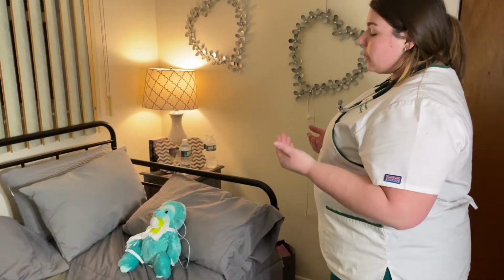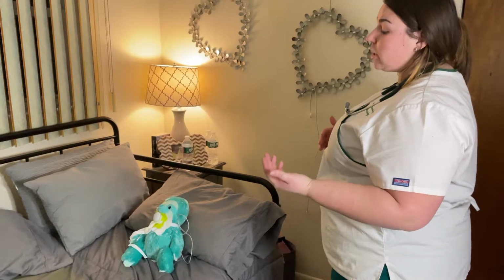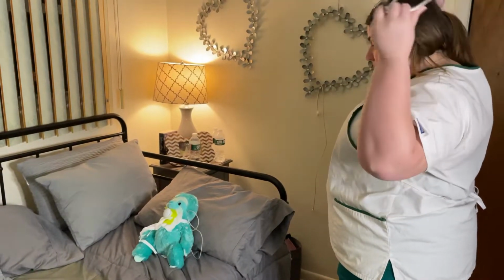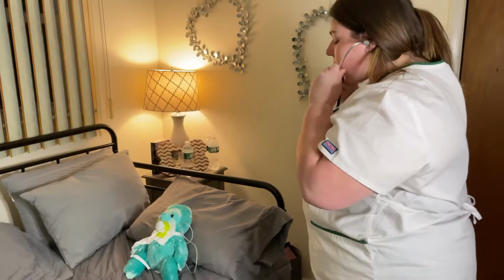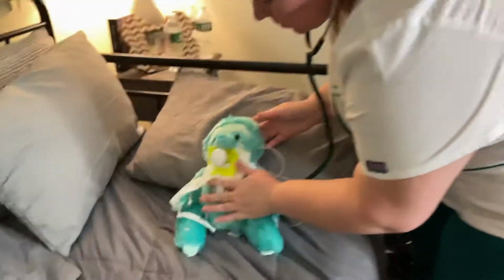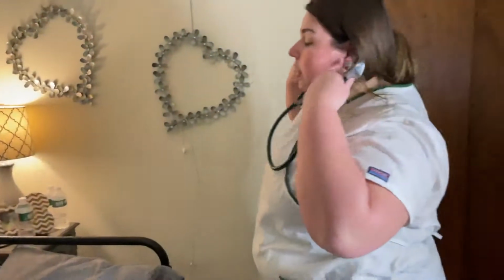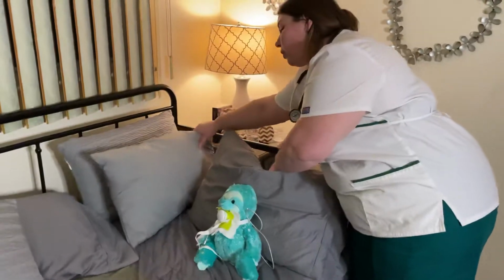know. The reason that we're doing this is I noticed your respirations were at 22 breaths per minute, which is high, and your O2 saturation was at 92%, which is low. So before we begin, we're just gonna get some vital signs, and I'm just gonna assess your lung breath sounds. Okay, very good. So I'm going to put the bed in a high Fowler's or a semi-Fowler's position, which is optimal for doing your trach care.